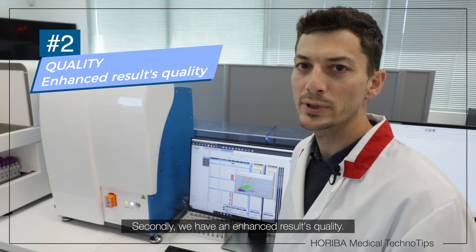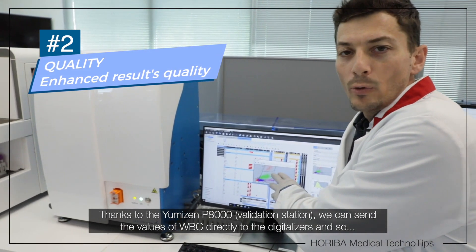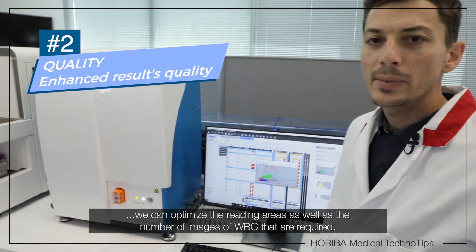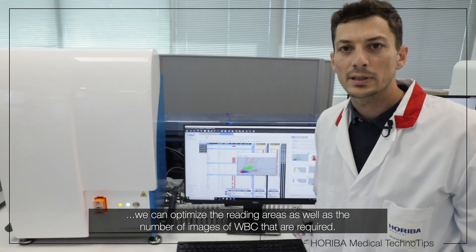Secondly, we have an enhanced results quality. Thanks to the Yumizen P8000, we can send the values of the white blood cells directly to the digitalizers, so that we can optimize the reading areas as well as the number of images of white blood cells that are required.